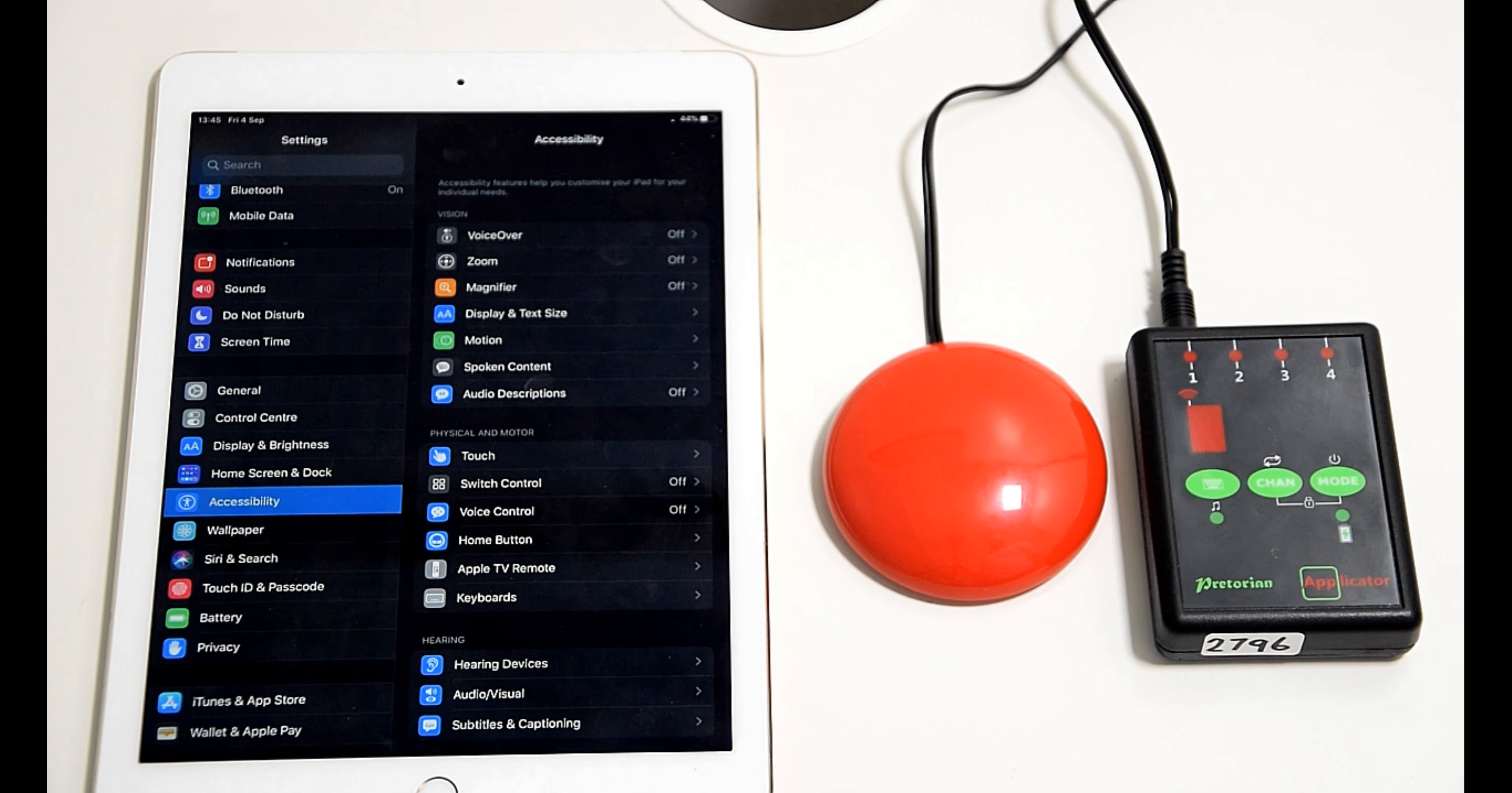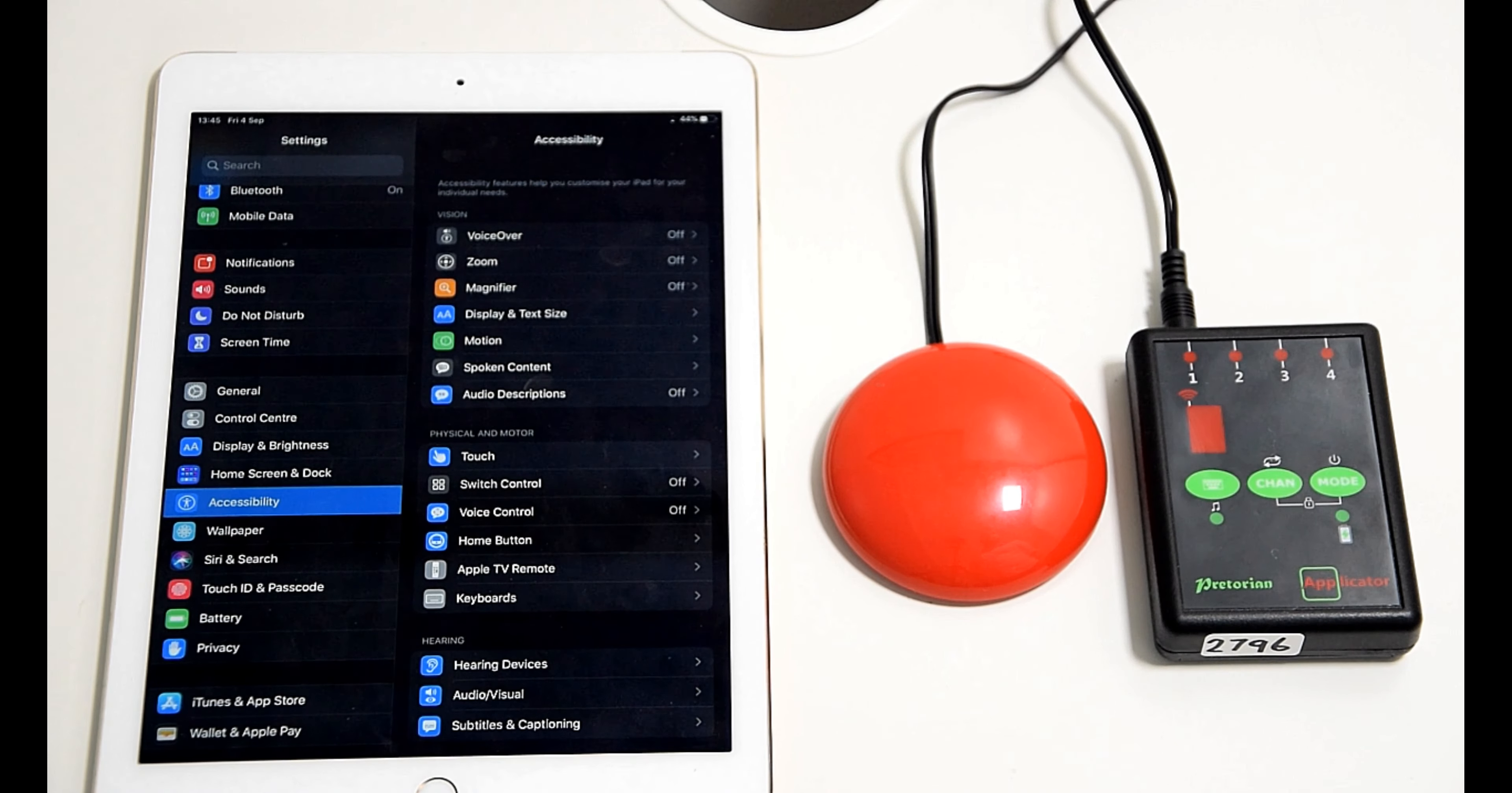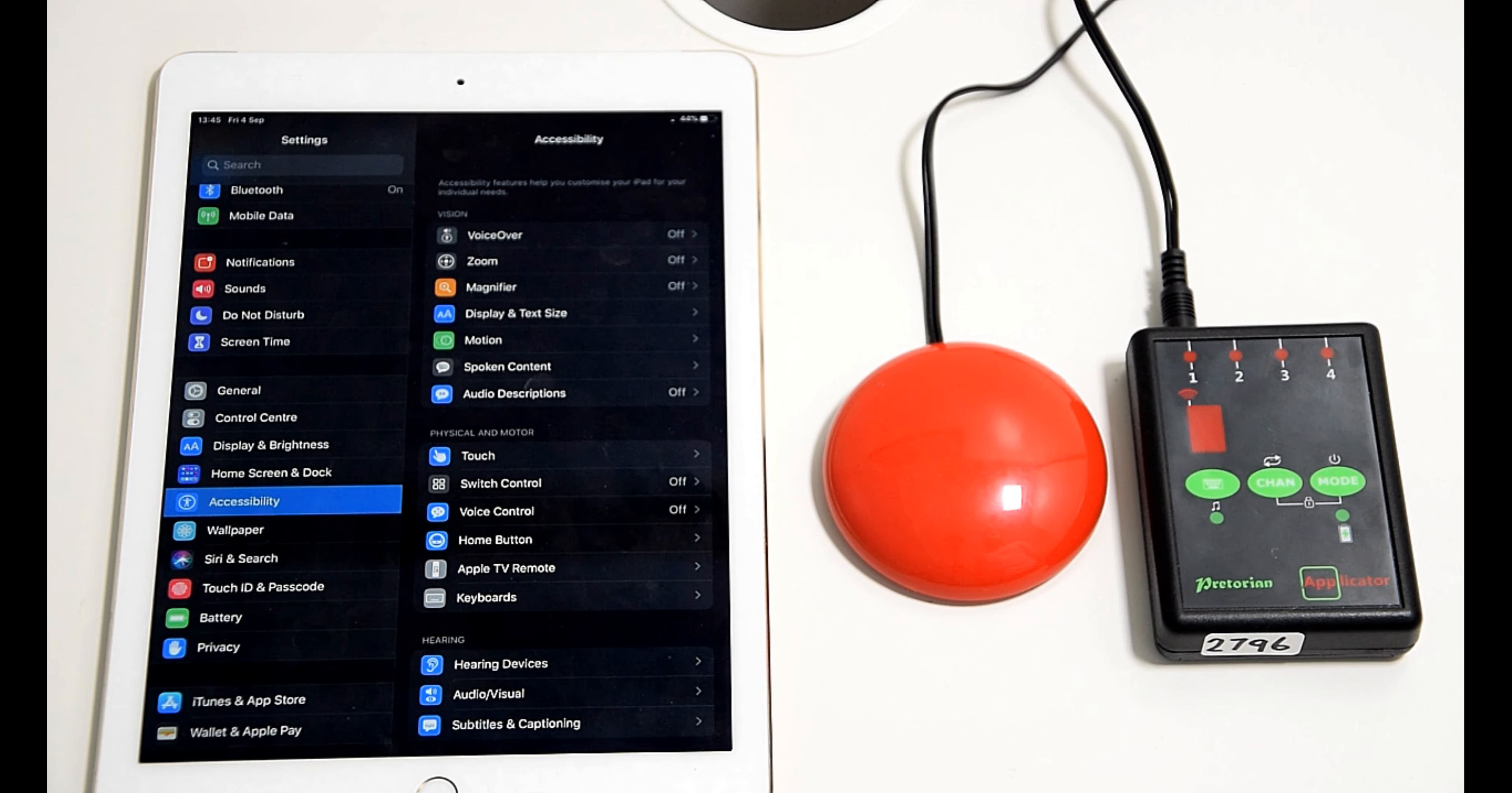Auto scanning is, as in the title, it will scan automatically for you and your switch will determine what you select within the boxes.